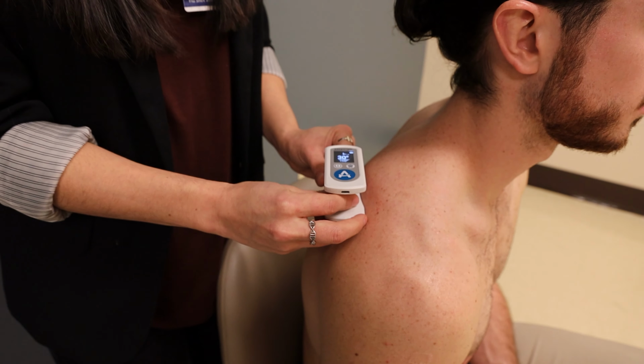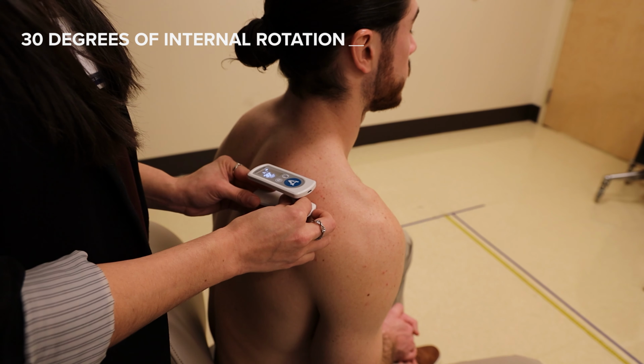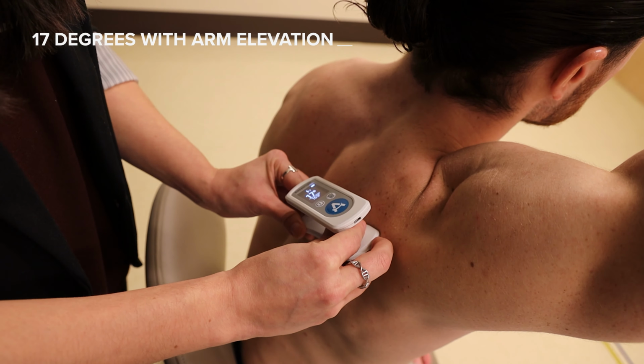So he's resting at about 30 degrees in the frontal plane. So I'm gonna have him elevate his arm up as high as he can. So now we're at about 17 degrees. So 30 minus 17 is 13 degrees. Go ahead and relax. And that's the excursion that he's moving into external rotation. So those are the 3 different motions of the scapula, and we're all measured with the Easyangle.